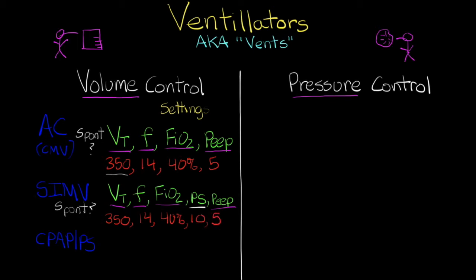In this example, these are pretty minimal vent settings that we could have for a patient. But I do want to talk about the pressure support. Typically 10 is the lowest that we will go for pressure support, specifically when we're on SIMV. You usually don't see this increased a whole lot. Maybe 15 or 20 is probably the highest I think I've ever seen that go up to.